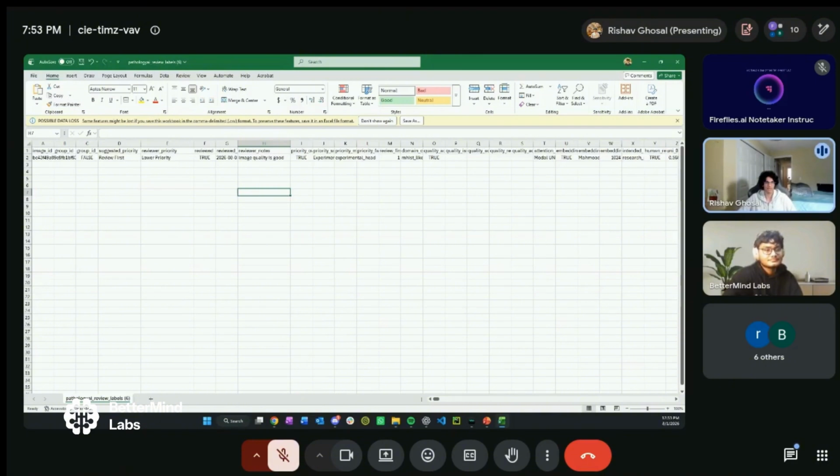So users don't have to guess as much or need as much past experience. Those are the main things, and then also adding shared review queues so people can work together in the same workspace and add review notes together.